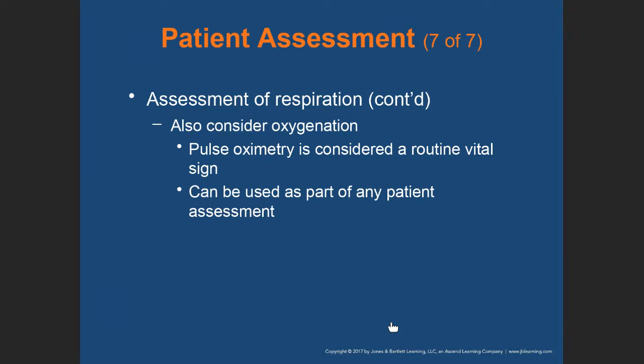However, don't get in the habit of treating numbers. You look at what the device is telling you in terms of numbers, and you need to ensure that the patient presentation matches what the numbers are telling you. At the end of the day, you treat the patient presentation, not numbers. A patient can be extremely hypoxic and the pulse oximeter is giving you a normal reading. So don't get in the habit of treating numbers.